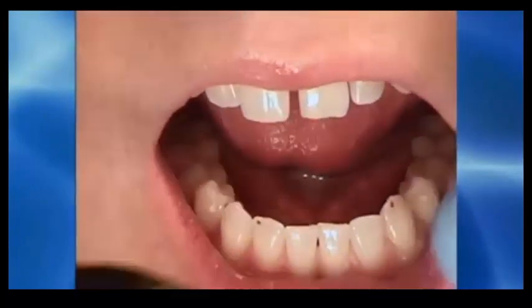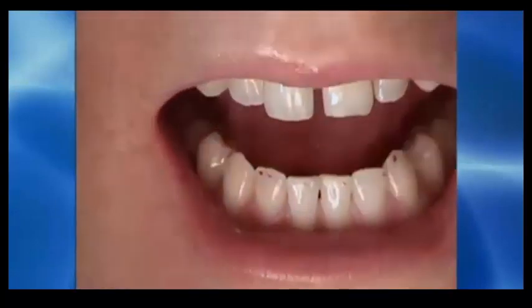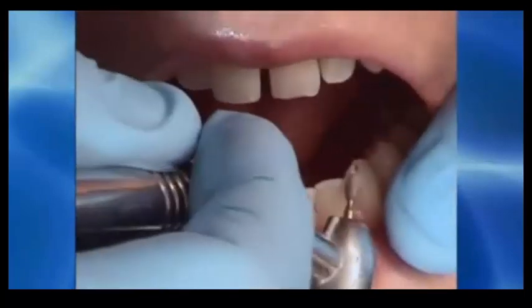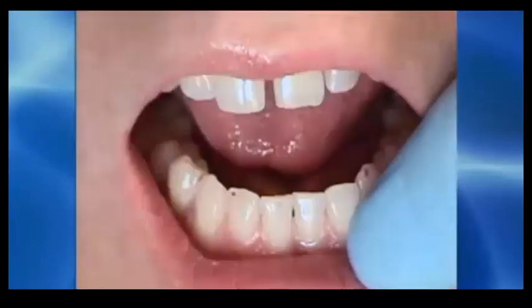So we will remark the teeth in the patient's habitual closure in order to assess the remaining amount of surface engagement after one adjustment. You can see there's definitively less surface engagement, and I'll refine it some, looking for small contact points and lace-like marks that will be near the contacts that are desirable. And you see I'm planing the edges back at an angle.